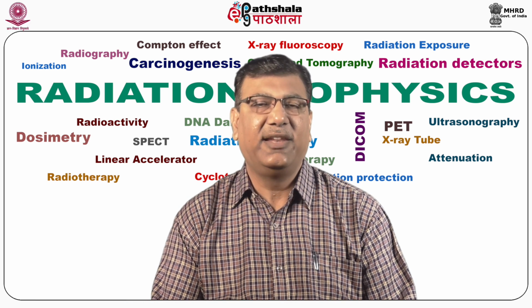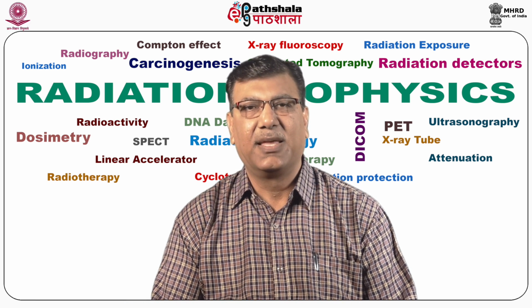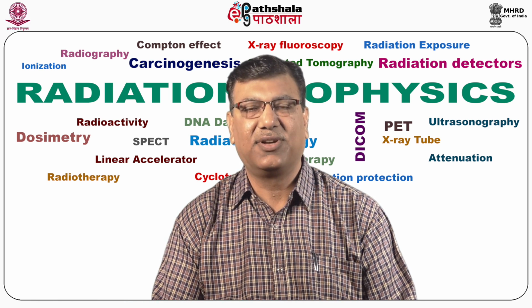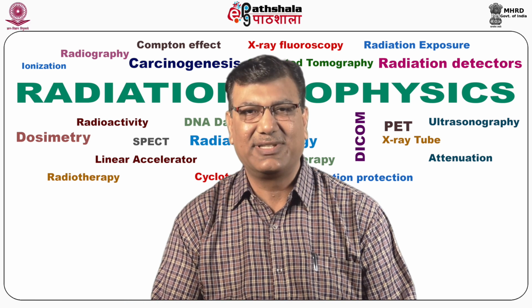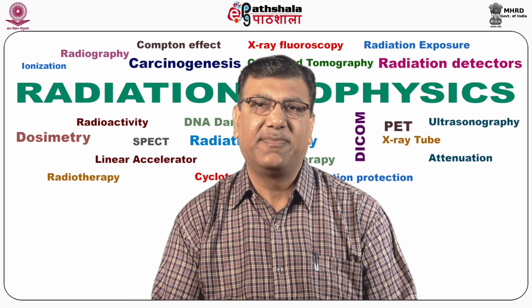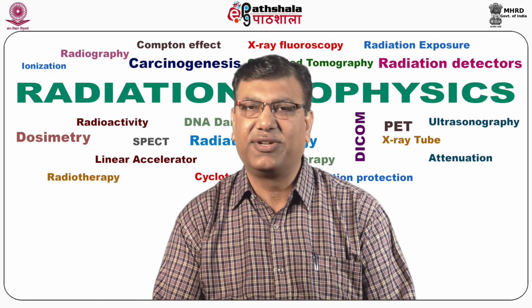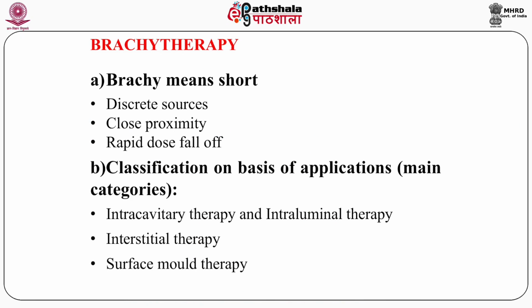And in a linear accelerator, where high energy photons are used, the source to skin distance is 100 centimeters.